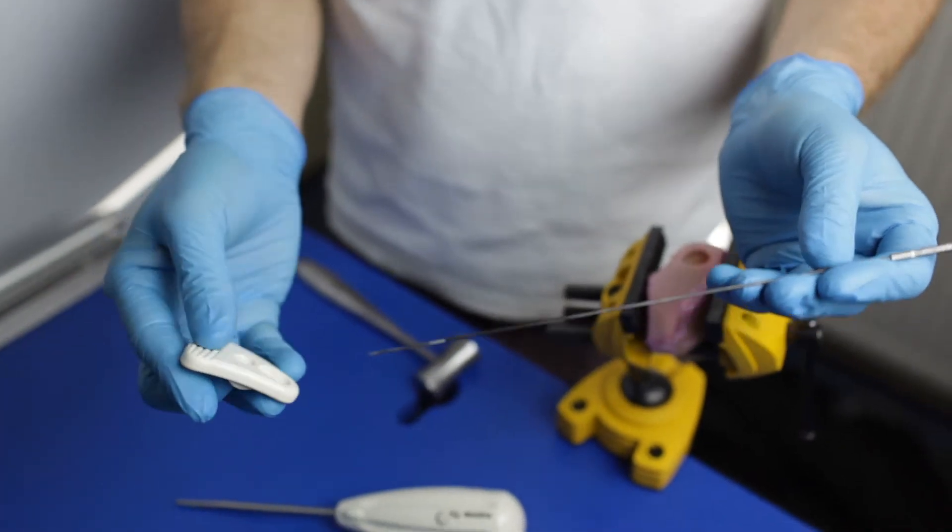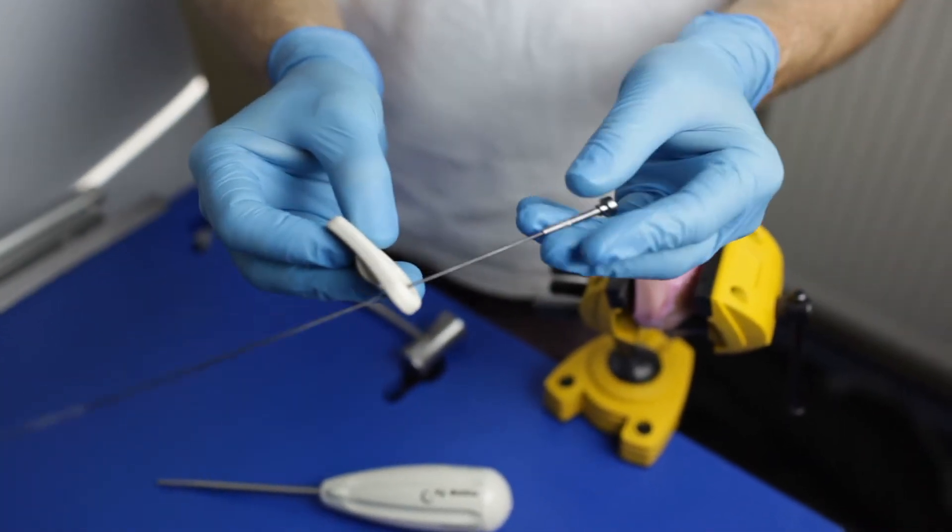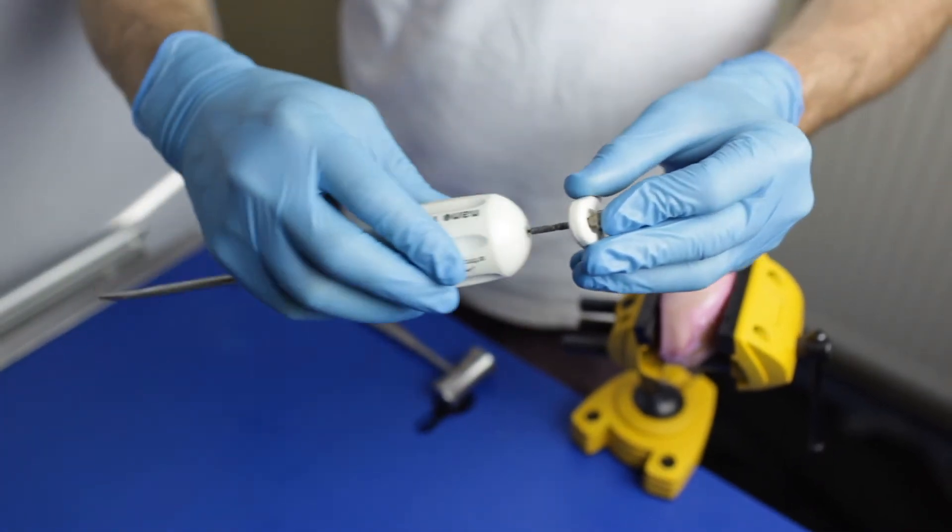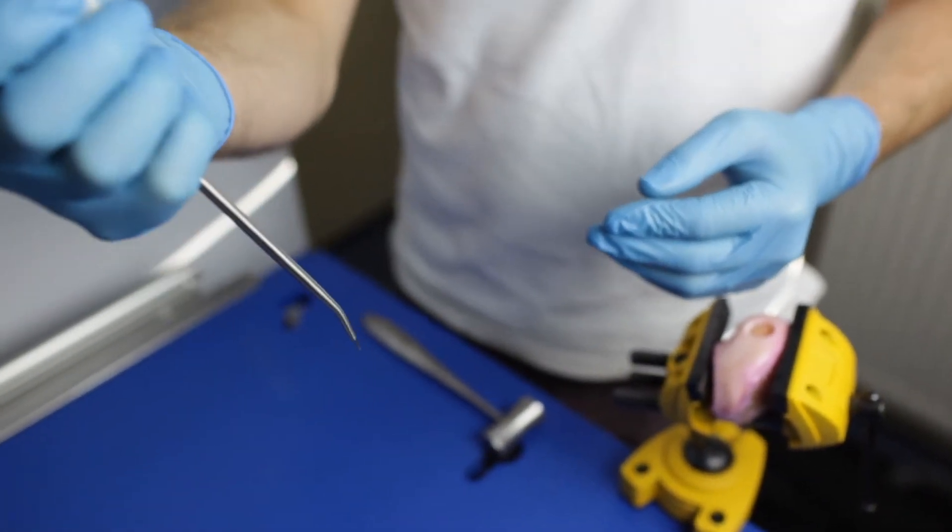Then you can use nano-fracture which will be sent out with the Prochondrix Set from joint operations to produce your microfracture holes, which you need to do with this technique.